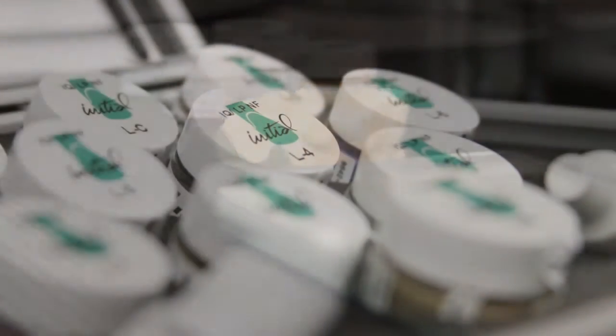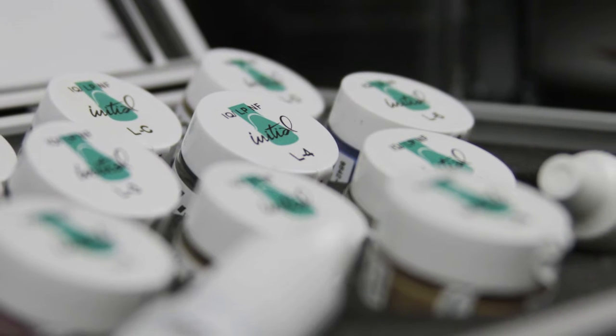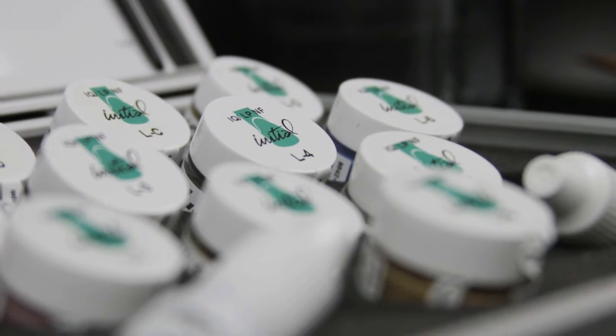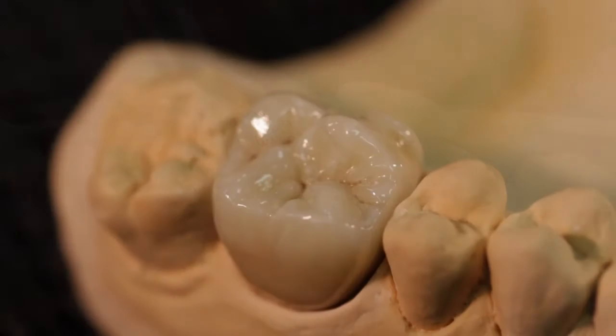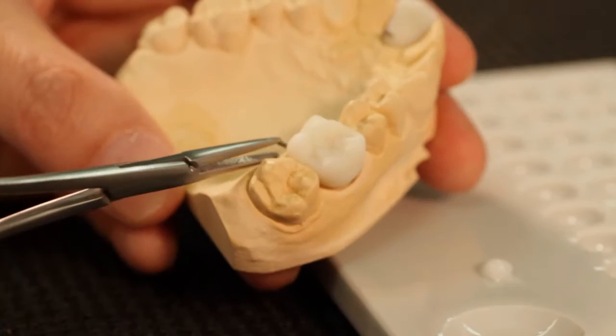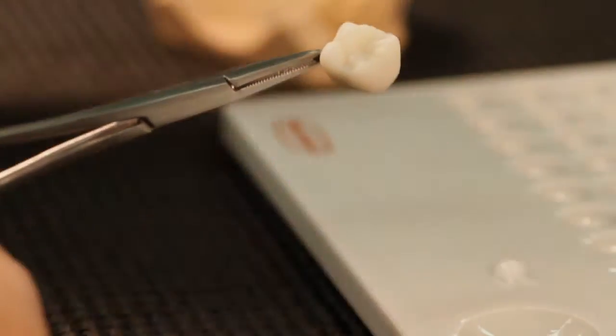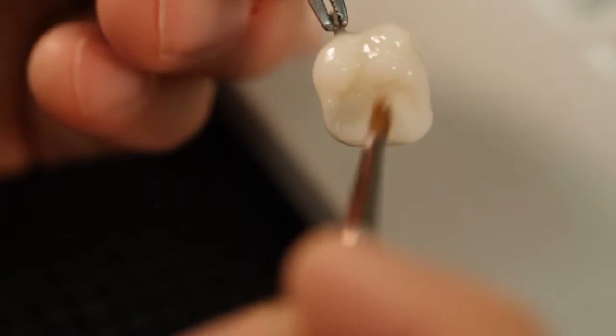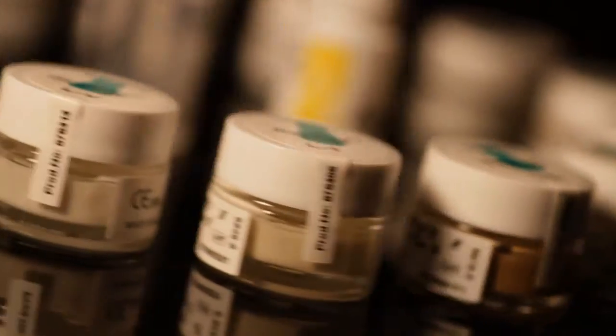Available in a ready-to-use consistency, the Lustre Paste NF are based on fine ceramic particles and can be applied in a thicker layer, where they will exhibit unsurpassed vitality and a very natural glaze to your restorations. The Lustre Paste NF are a one-for-all solution for the complete Initial line from GC, usable in a wide CTE range between 6.9 and 13.3 to work with nearly all types of ceramic.